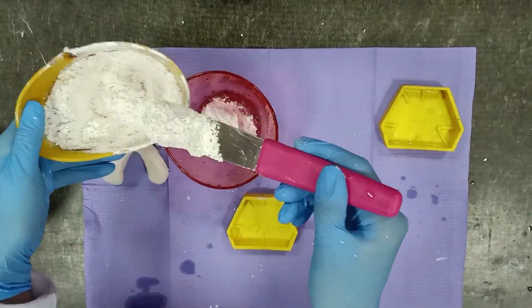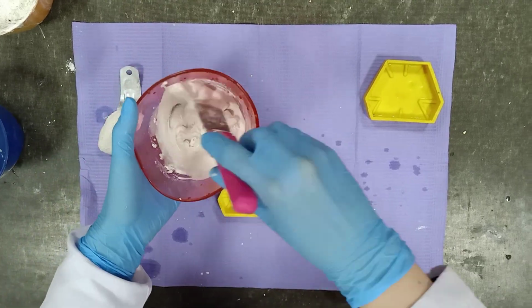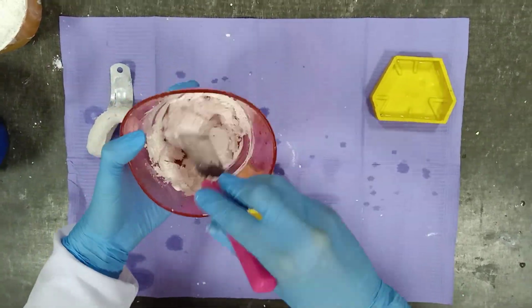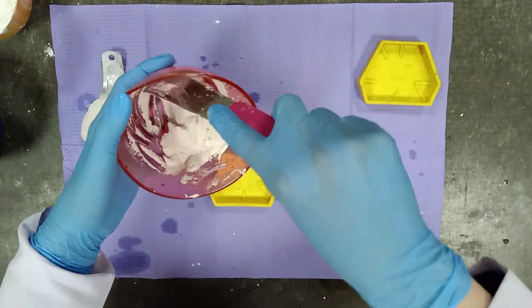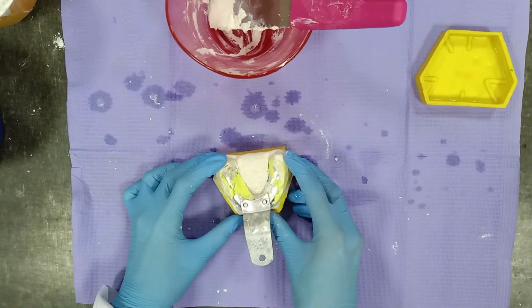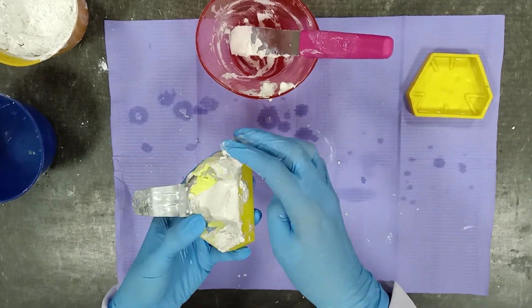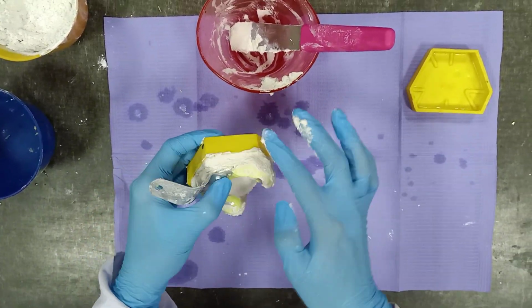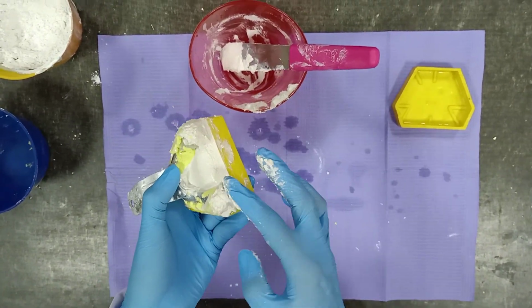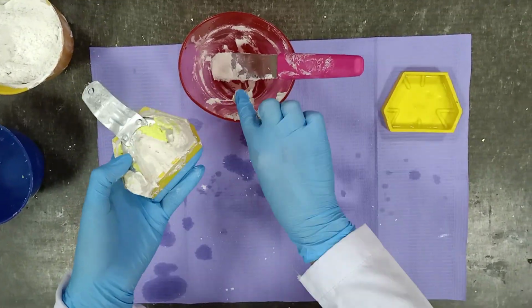For the second layer, make a little bit thicker mix, add it in the base former, and now invert your impression into the base former and trim the lingual side and keep adding any missing parts until you get smooth surface.